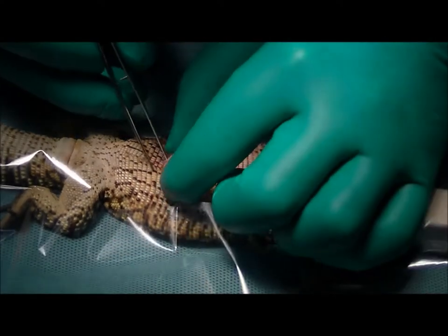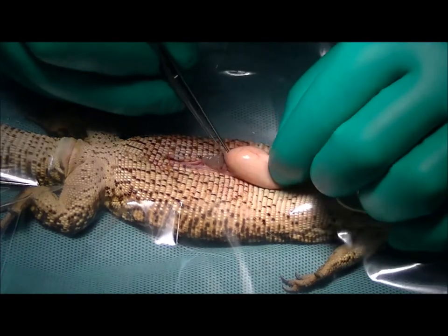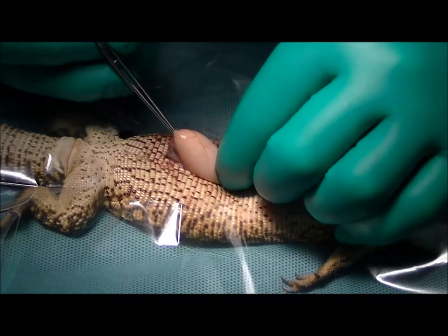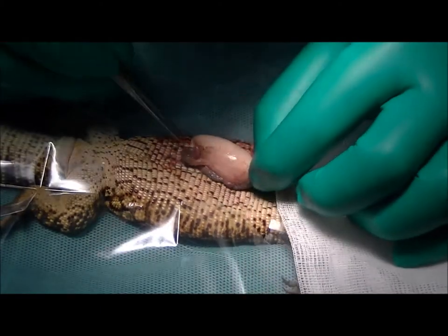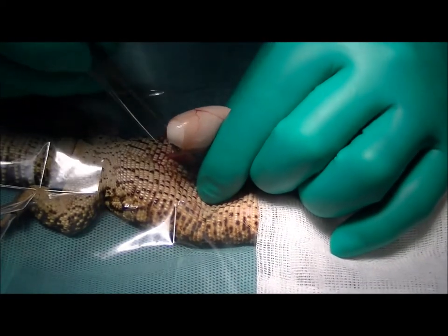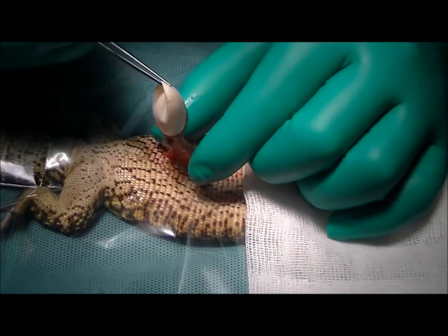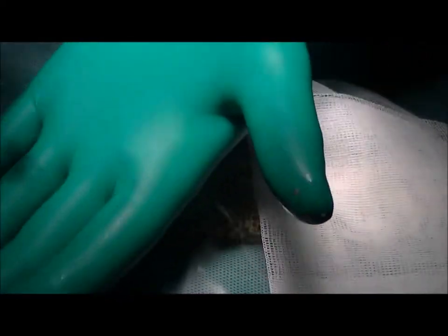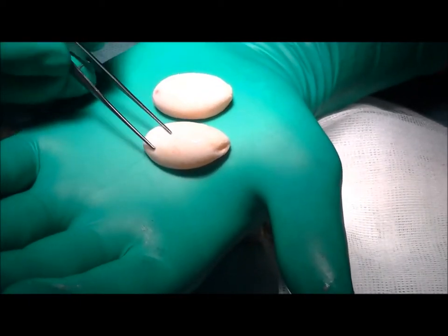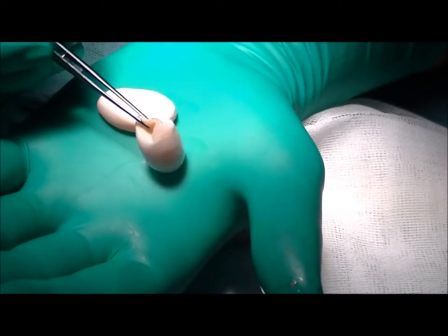For our second one, we'll hopefully be able to squeeze it up through that same incision. I'll just grab the end of it gently — here it comes. Again, very soft. There's the first one, there's the second one. They're both about normal size for this species, but I think they're just completely infertile slugs. She just hasn't been able to push them out.